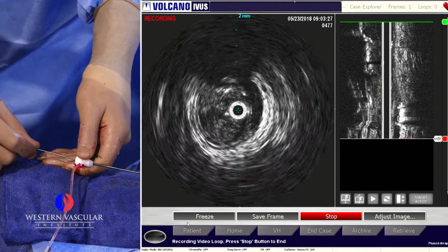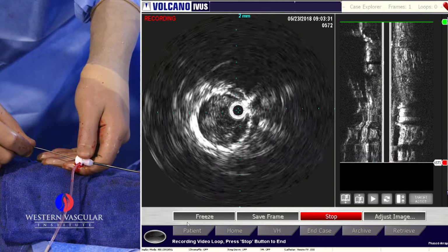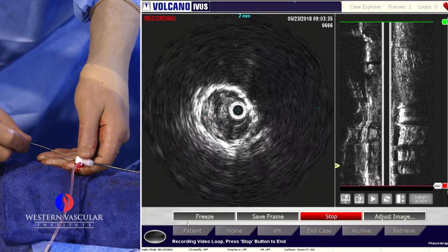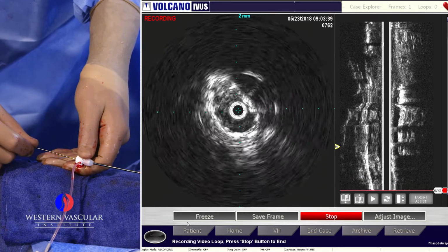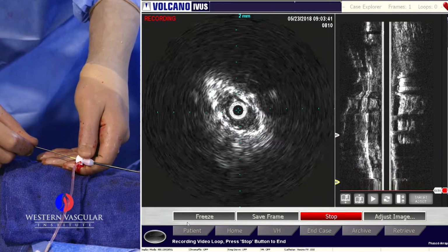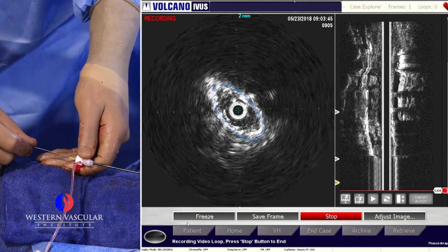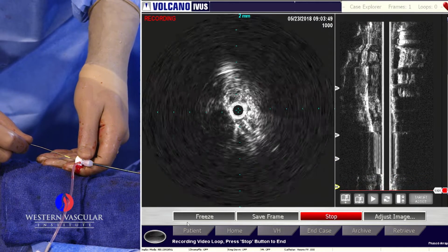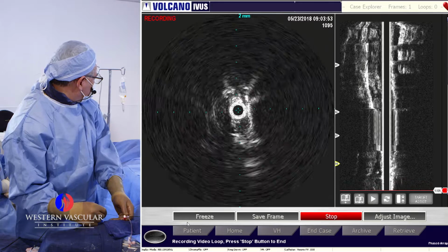Pretty soon we're going to approach the stent, and you will see the very bright marks of a stent right there. Sometimes it looks like a sunburst coming off every time that we pass a cell. So we are in good location. Look at the stent here. It's completely collapsed. It's almost like an egg shape right there. Very tight right here in this area. No wonder the vessel got occluded.